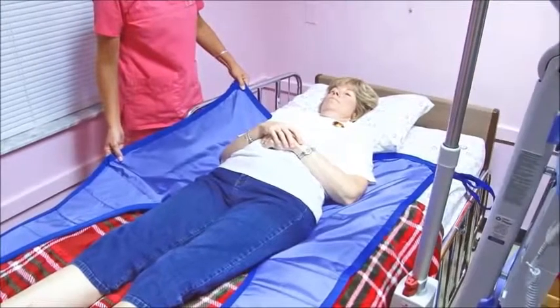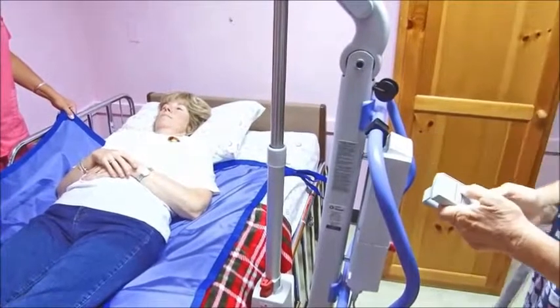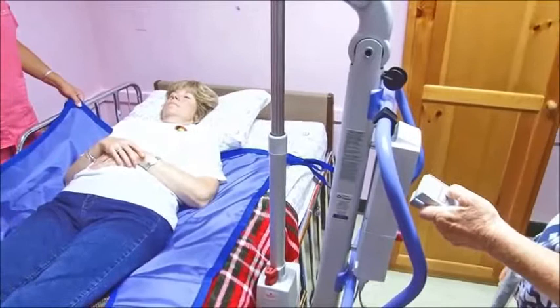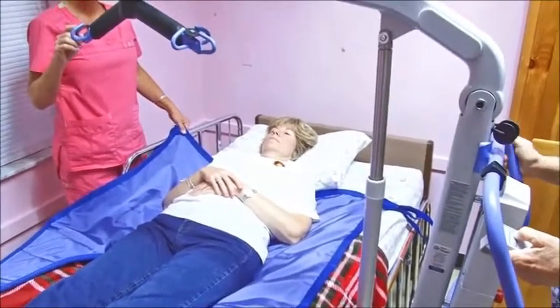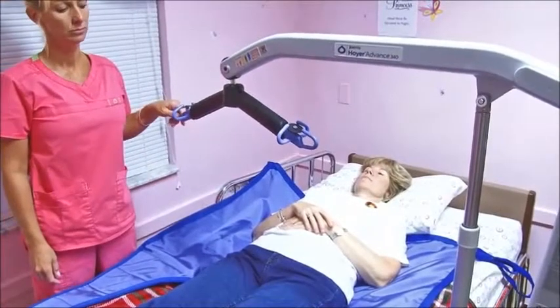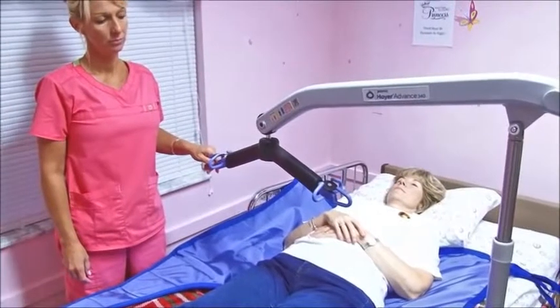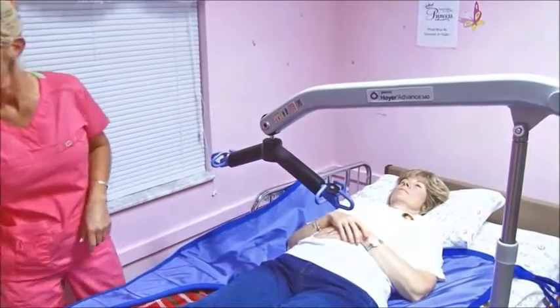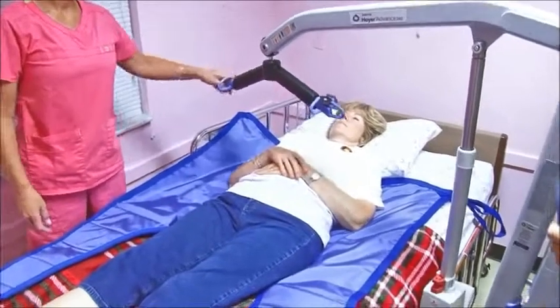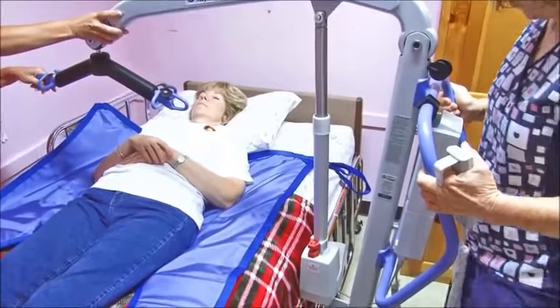We'll lower the Hoyer lift. Just pick the arrow that says lower. And it's going to be fairly low because we have to be able to put the hooks onto there. And you may have to reposition the Hoyer so that you can actually get a little bit closer up. Okay? And of course, relock.